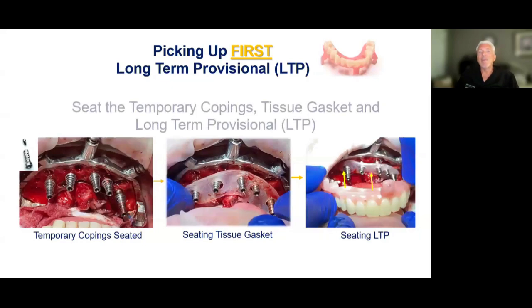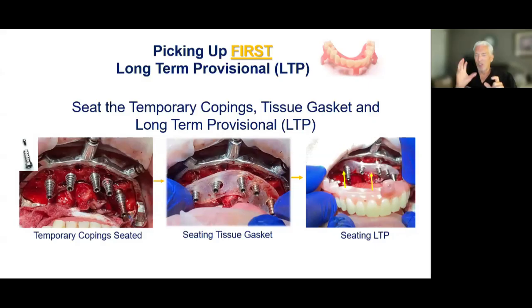Then as far as guided prosthetics, here the MUAs were put on. I did skip a slide where we have a template that you can put on that helps you get the right position of the multi-unit abutment.